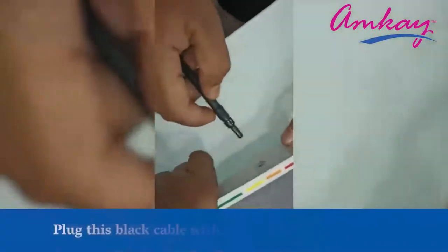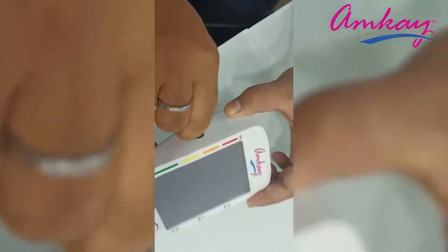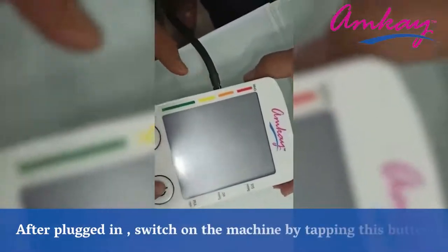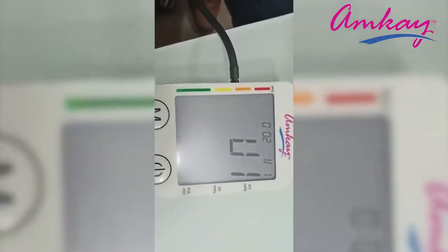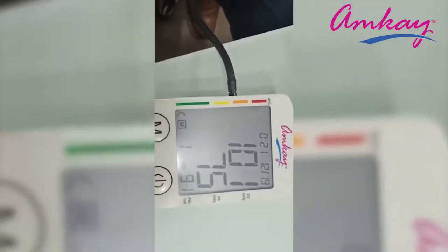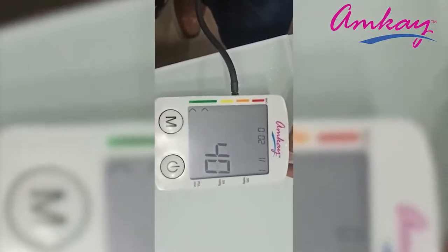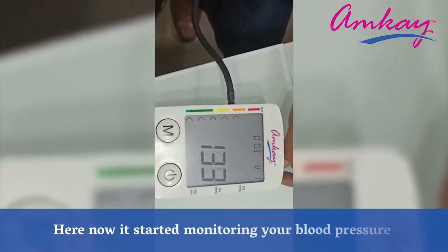Plug this black cable with the monitor on its left side. After plugging in, switch on the machine by tapping the on button. Here, it has now started monitoring your blood pressure.